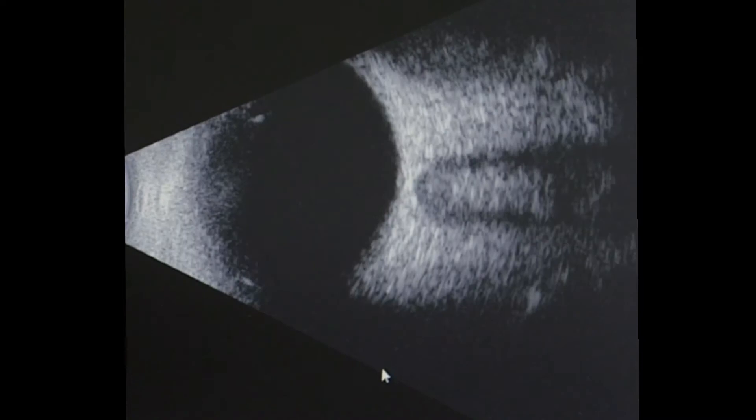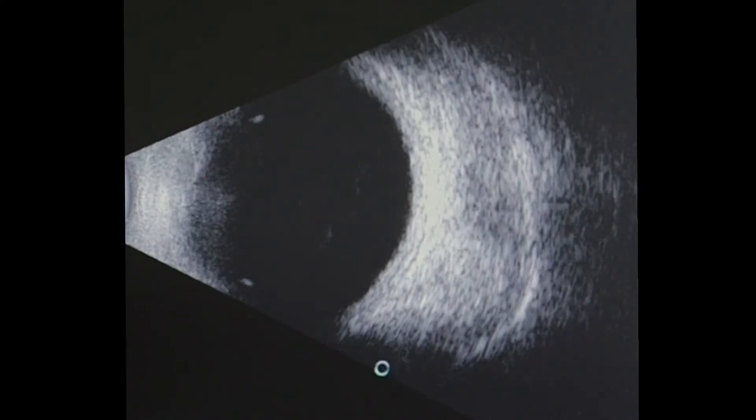The B-scan probe emits an oscillating 10 MHz beam, which returns information in the form of a two-dimensional echogram, an image of a slice of tissue in the plane of the oscillation.